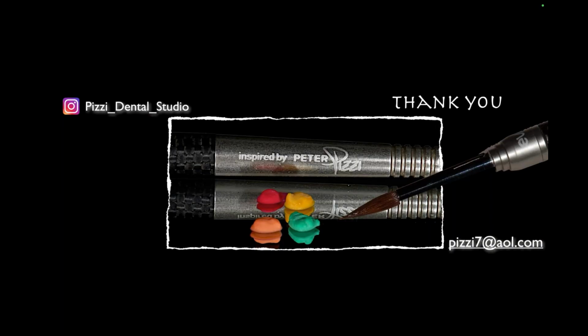The only thing that would change the game, speaking of opacity and translucency, is how much other space do I have to fill, right? So if I have to extend it 2 millimeters, then a lithium disilicate's a problem for me because I'm going to have to be super translucent here. I'm also going to be pretty translucent here. So that's going to be kind of a challenge for me.